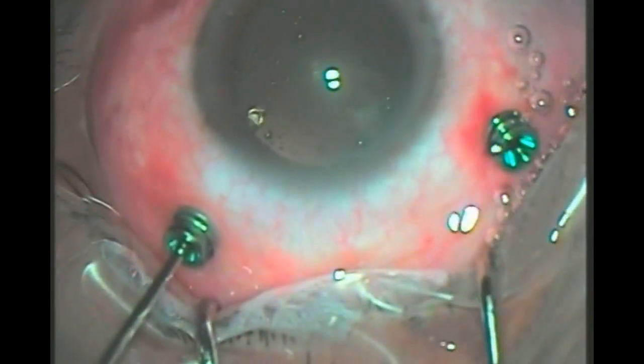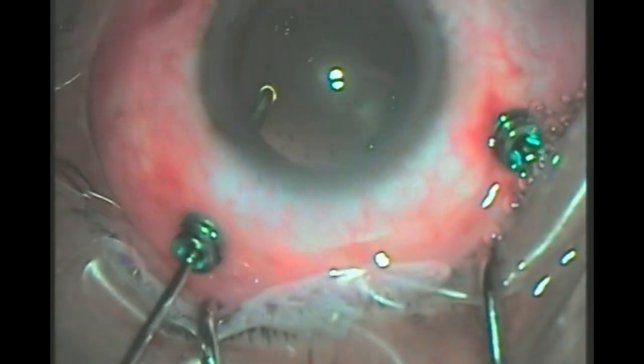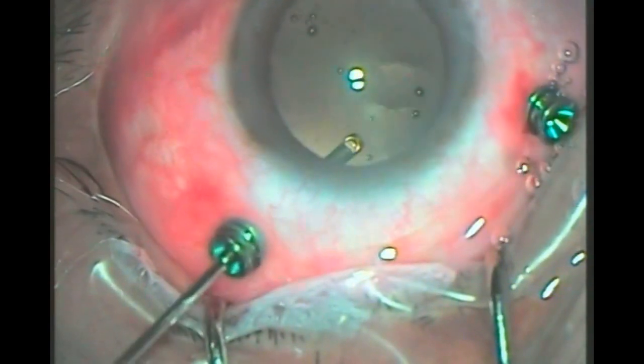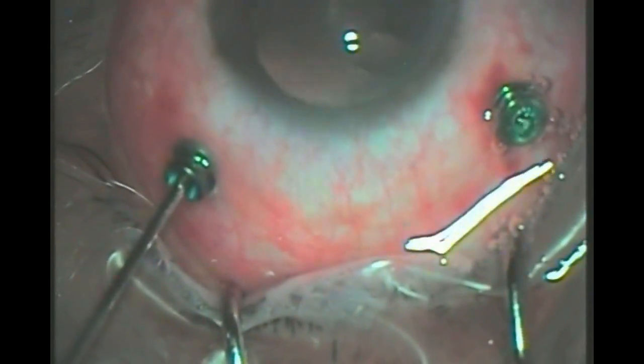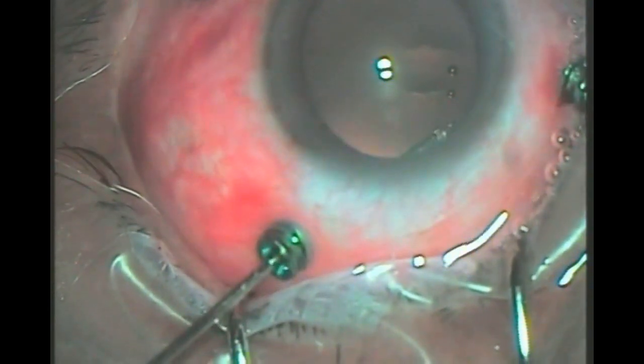Through one of the sclerotomy ports, push the saline and air mixture briskly with the needle pointing toward the center of the globe. This maneuver breaks the saline air mixture into numerous tiny air bubbles, which in turn rise and stick to the anterior vitreous layer. These bubbles appear to stain the anterior vitreous and also help to create a potential space between the posterior capsule and anterior vitreous face.